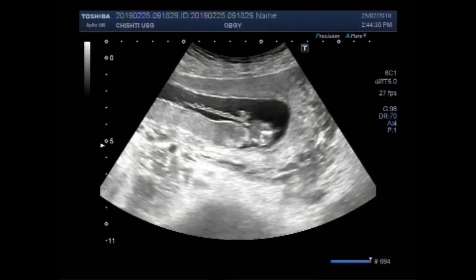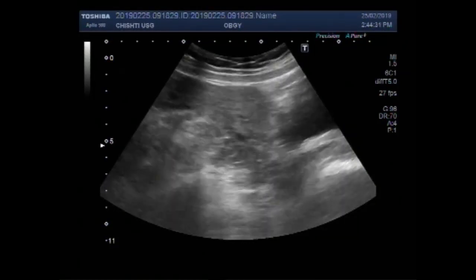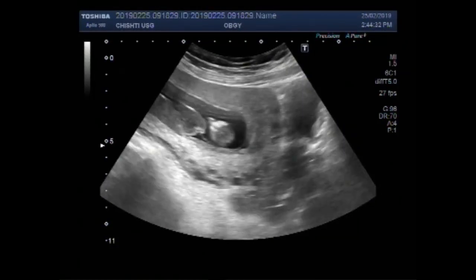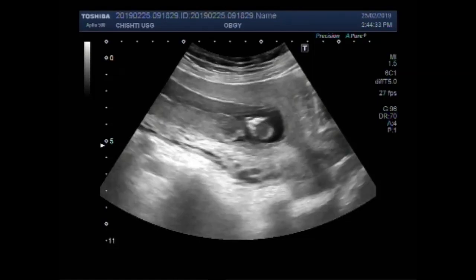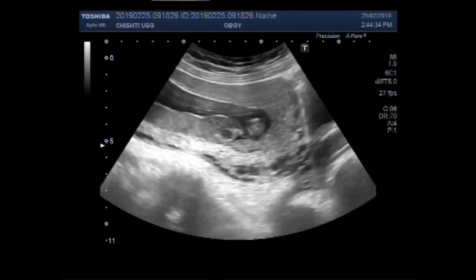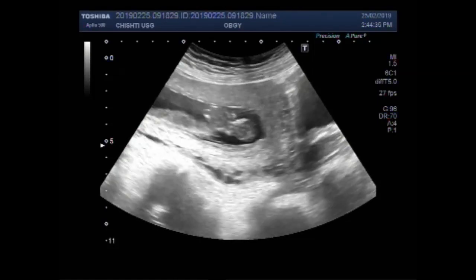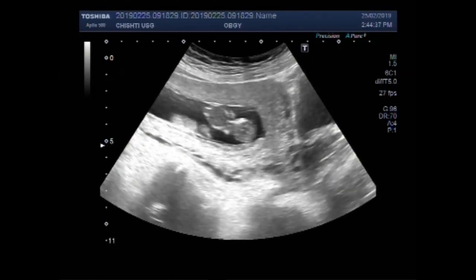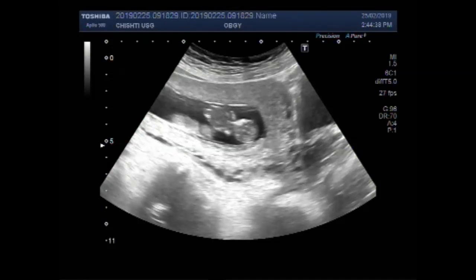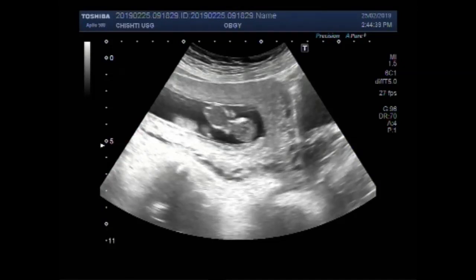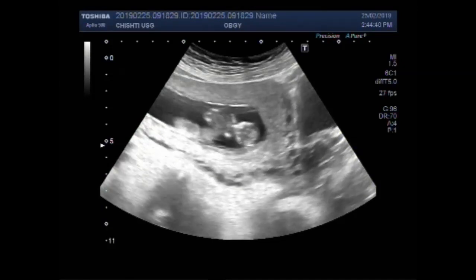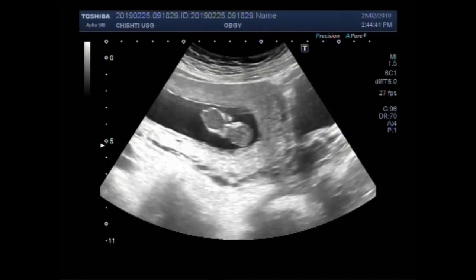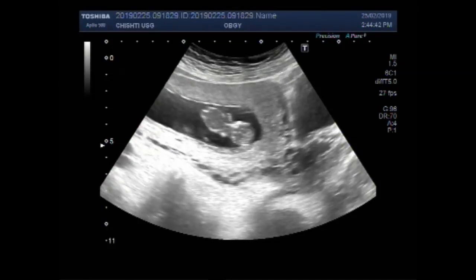Dear viewers, I hope you are all fine. This ultrasound video shows an early pregnancy with fetal demise. You can see the fetus inside the gestational sac.